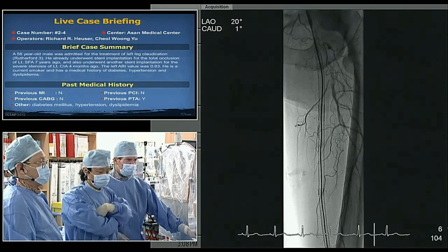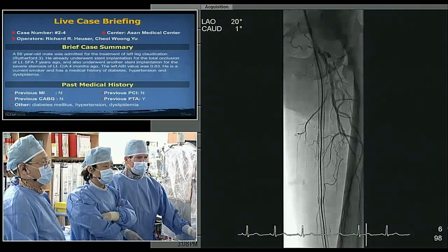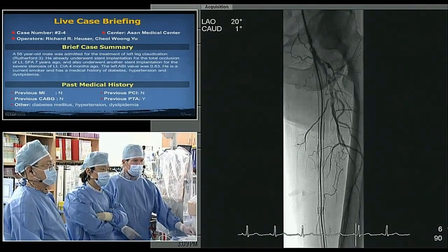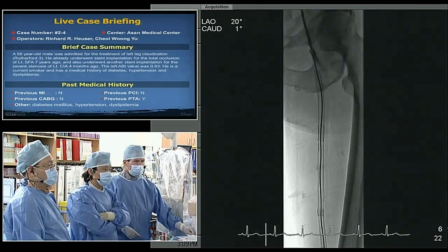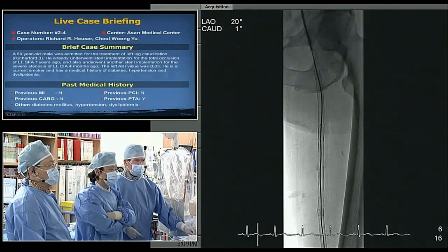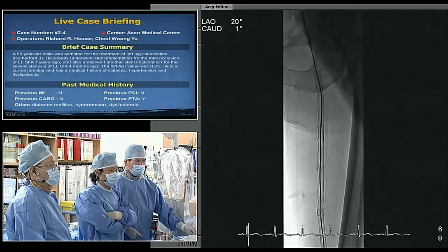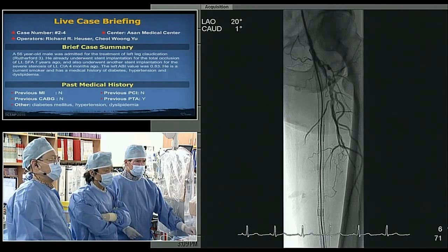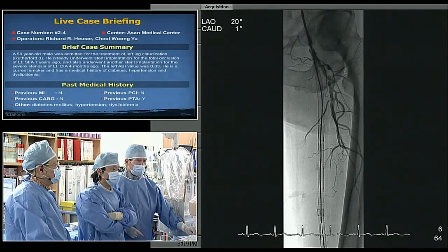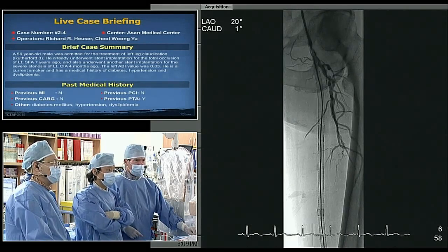Right. I think both of those approaches would have been good. Probably, if I was doing this in my lab, I might have gone with a laser simply because it's simple and easy. But you're already going to have a pretty expensive procedure with a bunch of drug-eluting balloons or drug-eluting stents. So a case could be made to use a regular balloon, but again, from an economic standpoint, I think the outcomes will probably be about the same.